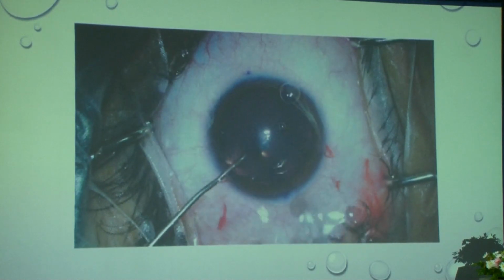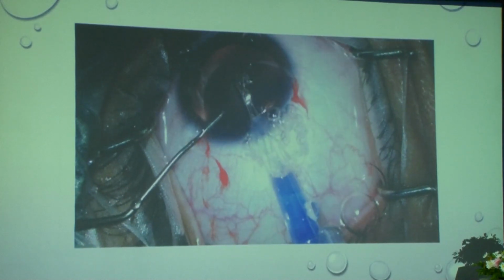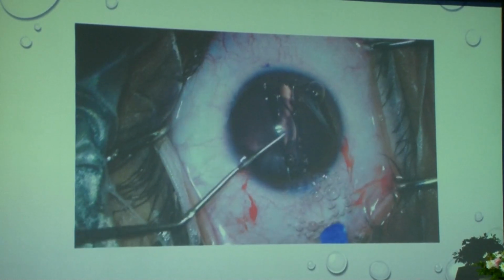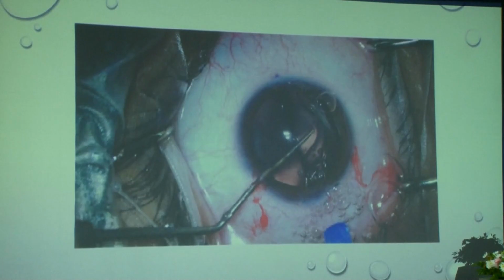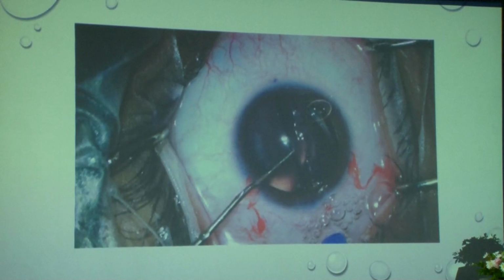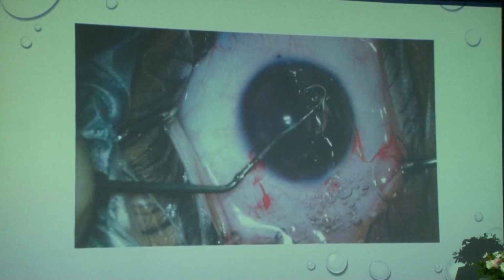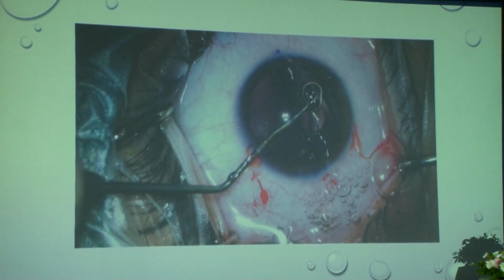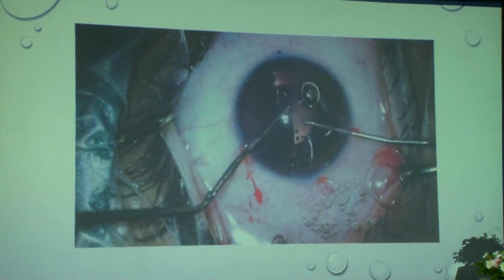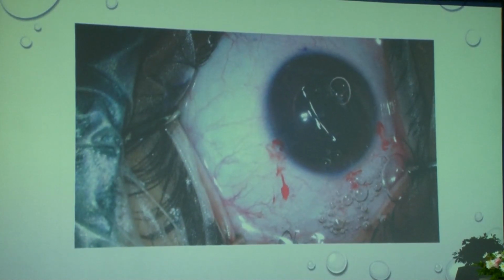Again my guard goes in from the left hand, and I'm injecting. You watch the bubble at 7 o'clock, which is going to be very important. Once my lens is inside, it's not opening the way I want. It's going to flip open on the other side, so I hold it there. You observe the bubble at 7 o'clock. I'm making sure that the lens is not opening. It is staying away. Now the bubble is between the instrument and the endothelium. Observe this. It remains till the end, and I just push it open from the other side, and the lens opens in a perfectly normal way.